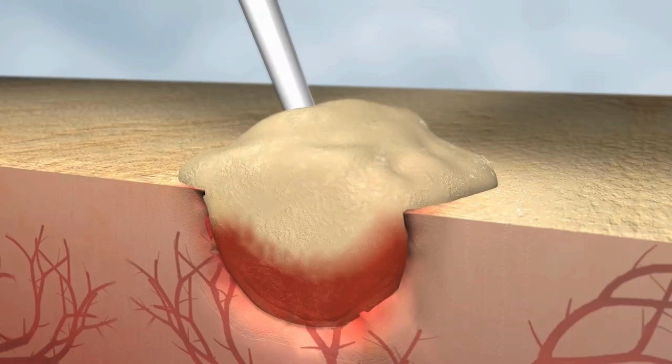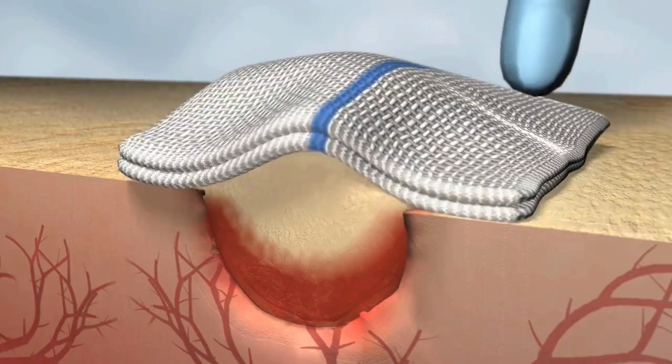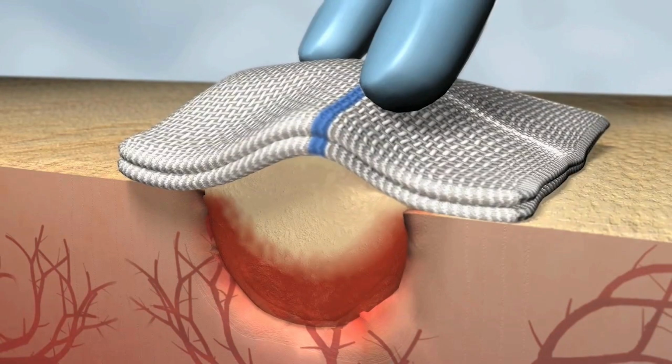The flowable nature of FLOSEAL allows it to conform to any irregular wound geometries and be applied in difficult-to-reach locations. After creating a cone-like mound of FLOSEAL over the bleeding site, immediately and gently approximate FLOSEAL to the bleeding surface with a moistened gauze sponge for 2 minutes.